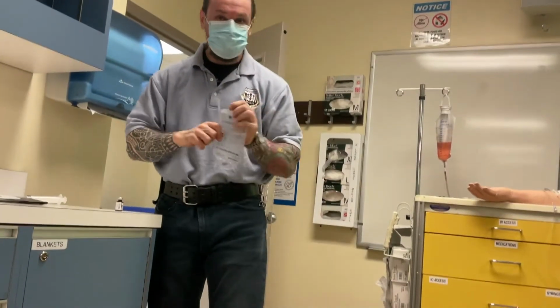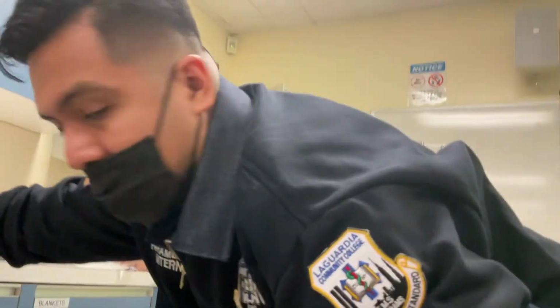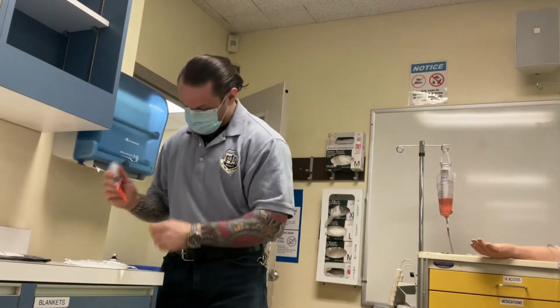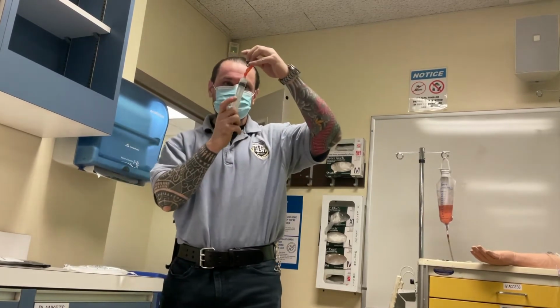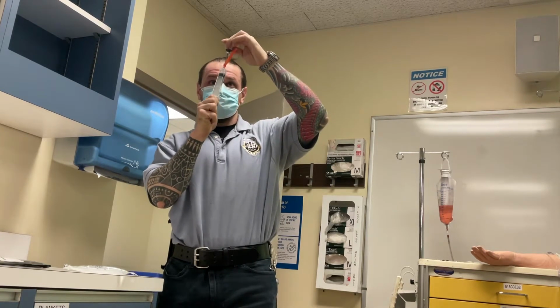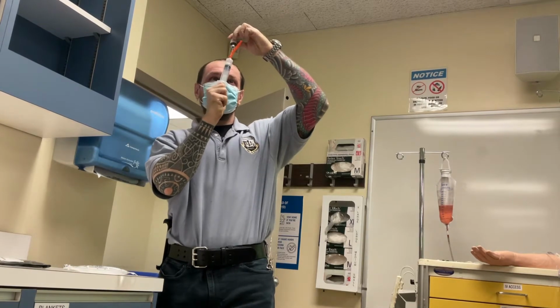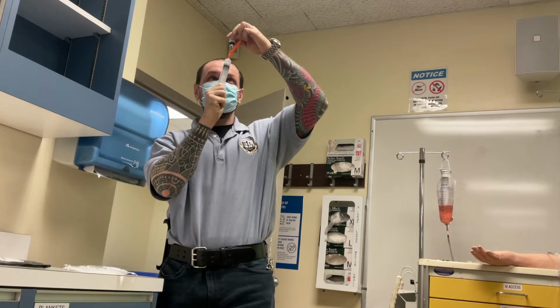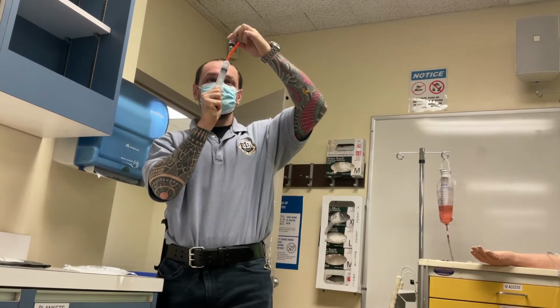All right, so clean the ports. So 3 ml, right? You put air in here, so this will allow me the ease of drawing up. You see how it's bubbling? Amiodarone has this property. What you want to do is be careful when you actually input it in your bag.